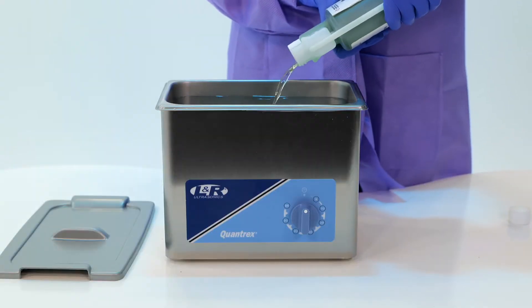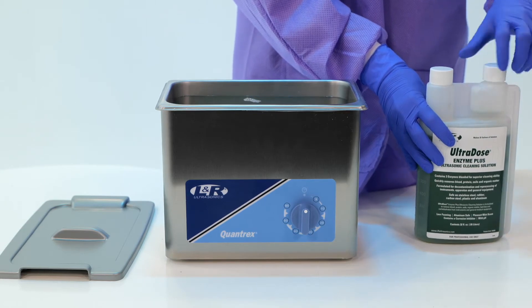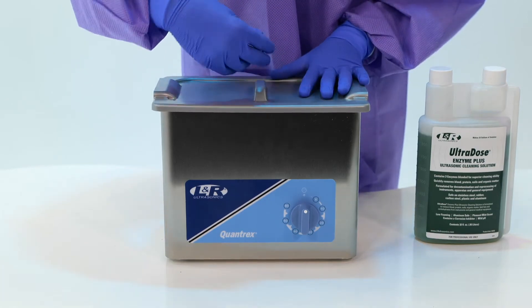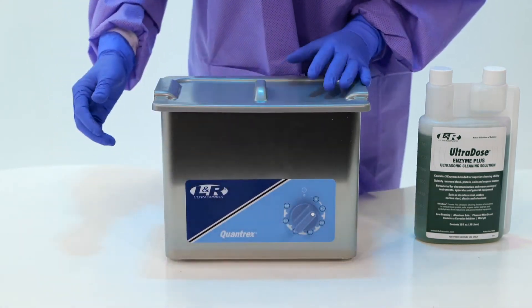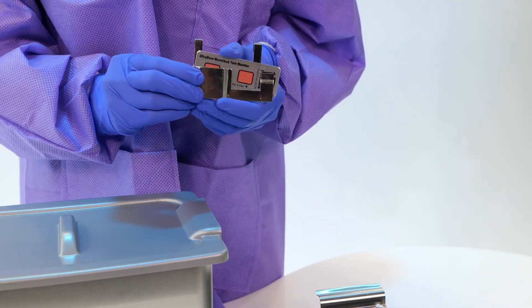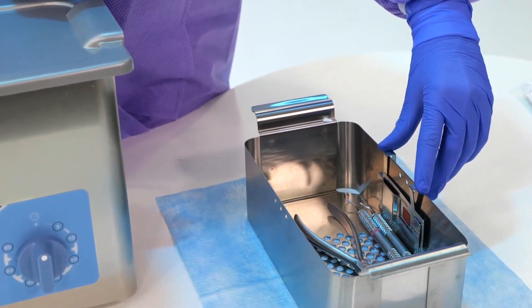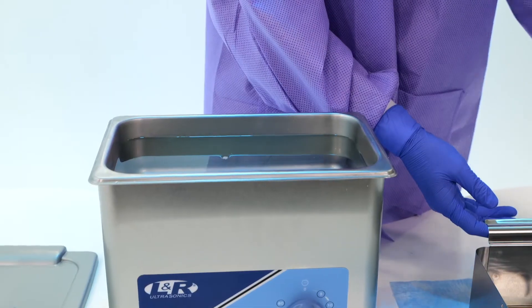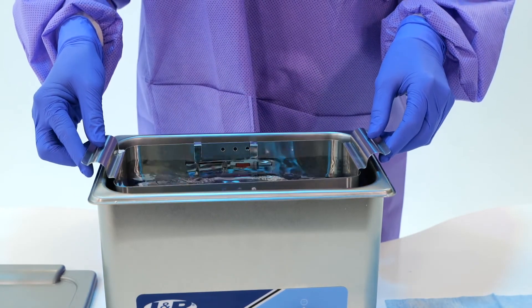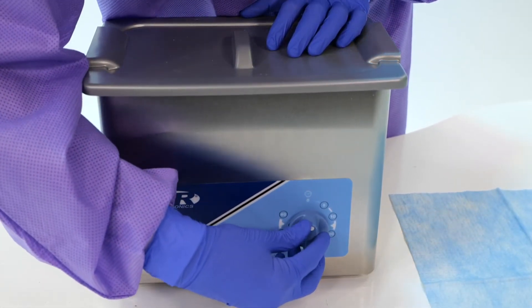To use, fill the cleaner with properly diluted LNR cleaning solution and water and degas the unit for 5 minutes. Place the WaveCheck strip into the holder and hang the holder on the back of the basket. Be sure that the holder is attached to the basket and the test strip is fully covered with solution. Run the unit for a complete cleaning cycle.